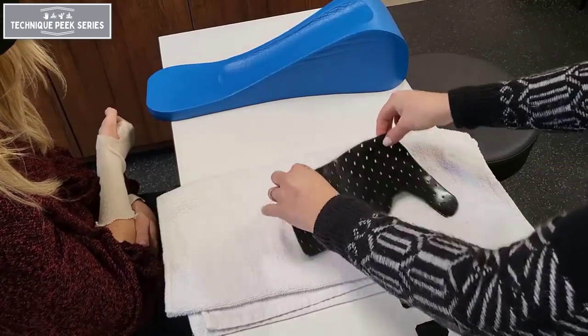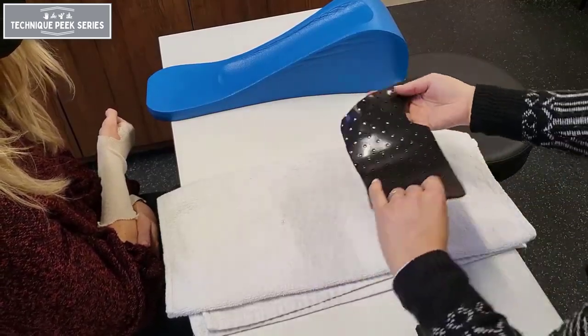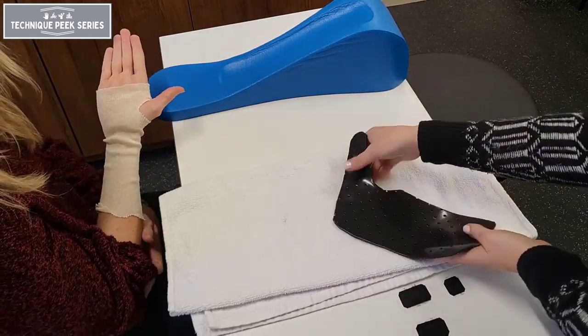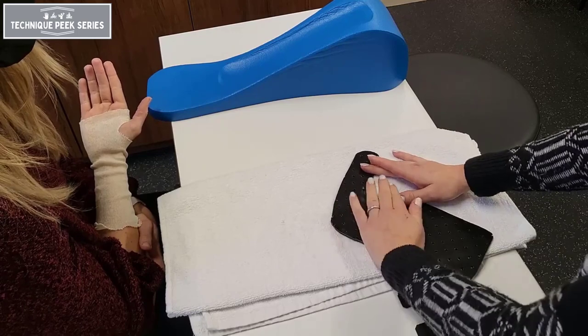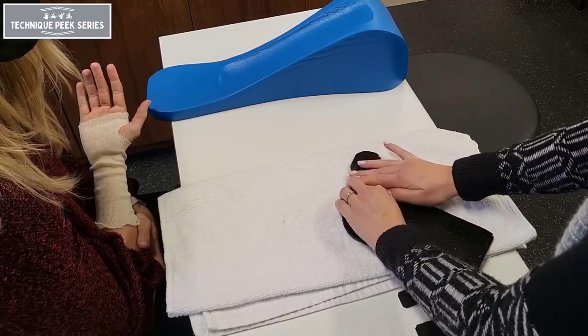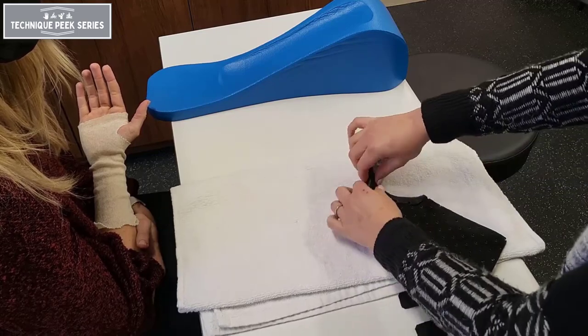Once your material is cut out and warmed up, you want to be sure you're working on the right hand. Check the fit on your own body, then roll out the thumb area and the distal palmar crease prior to molding onto the patient. This will enable greater ease with contouring onto your patient.